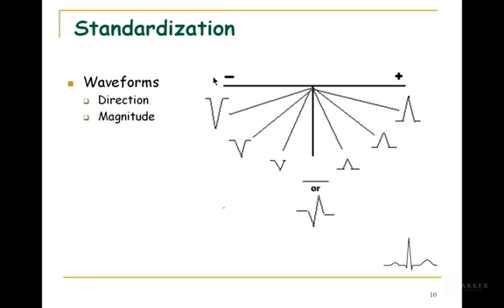But before we even do that, let's first say, if that wave of depolarization happens to be running towards the positive recording electrode, your deflection will be upright. That's standard. If the average direction of current flow is running towards the positive recording electrode, you're going to have an upwards deflection. If it happens to be running towards the negative recording electrode, you'll get a downwards deflection.